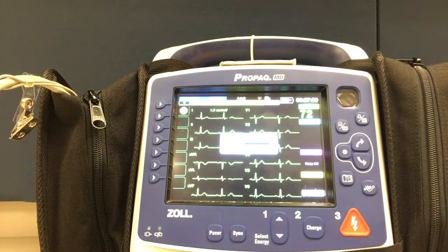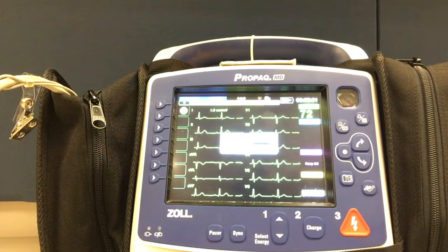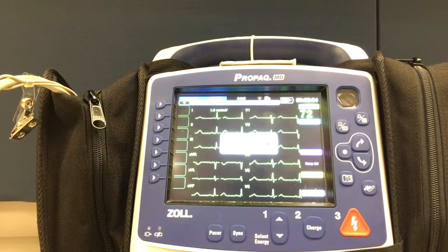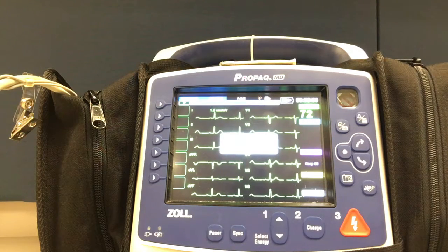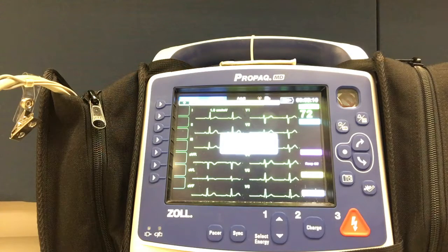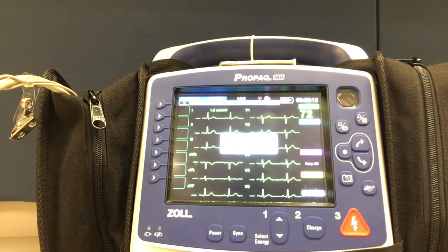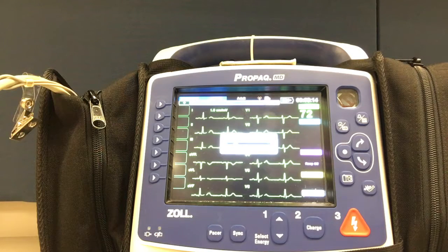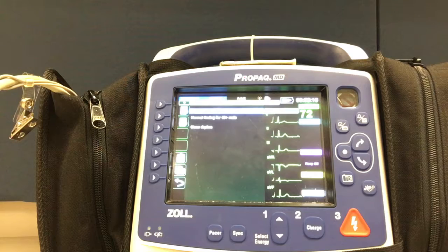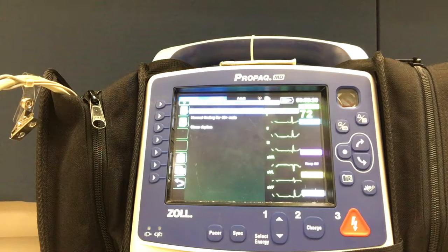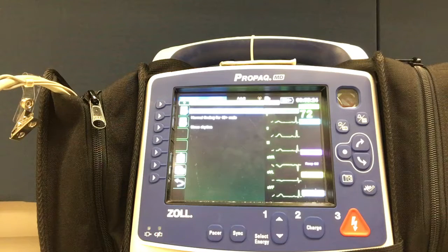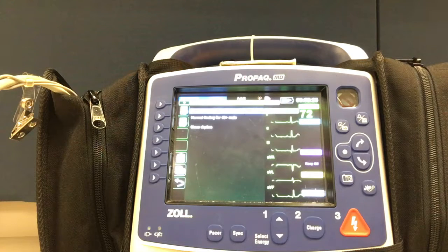The ProPakMD will acquire, diagnose, and save your EKG. The analysis has shown, in this scenario, a normal finding for a 40-year-old male in sinus rhythm.